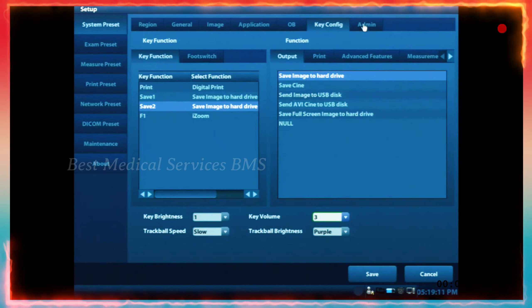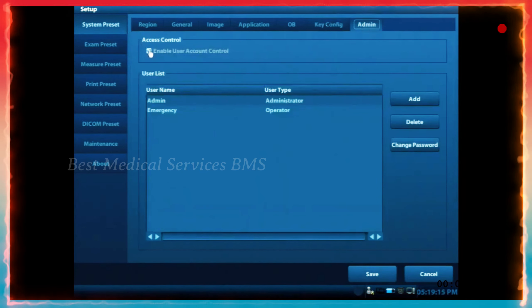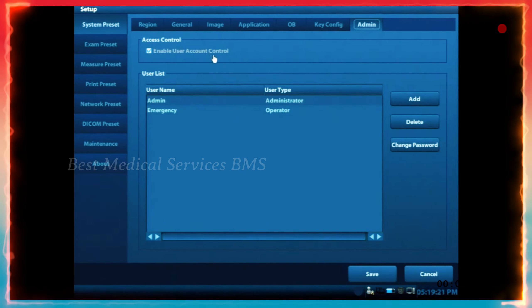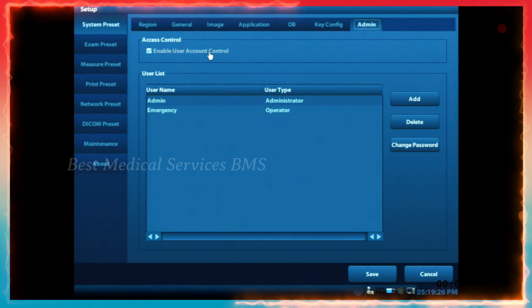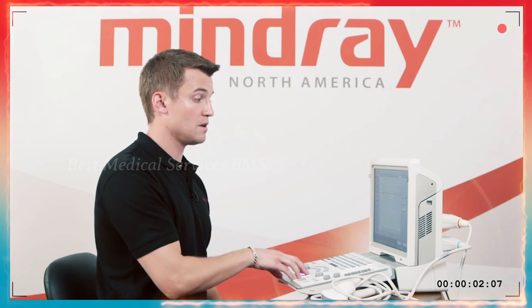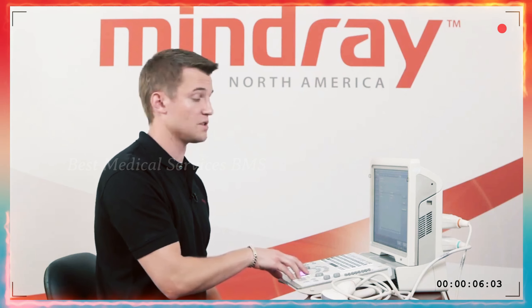Under the admin tab in the system preset, this is where you can disable or enable the user account control that appears when you first boot up the machine. Some people prefer to not have that pop up and go right to the imaging screen. Or if you wish, you can keep it enabled to slow down somebody trying to access the machine without permission.